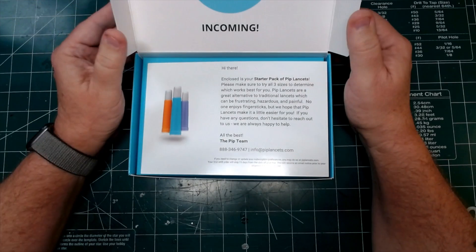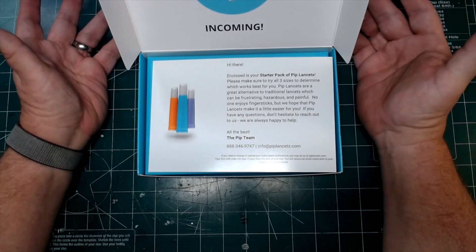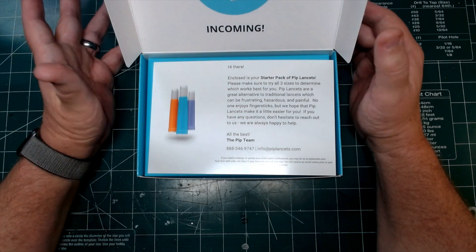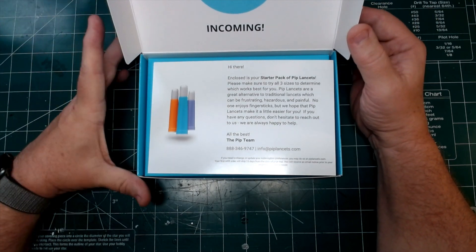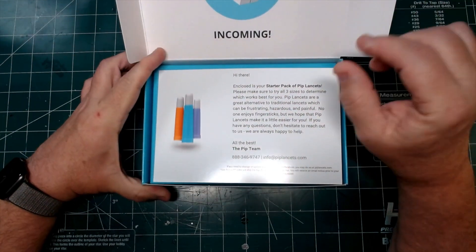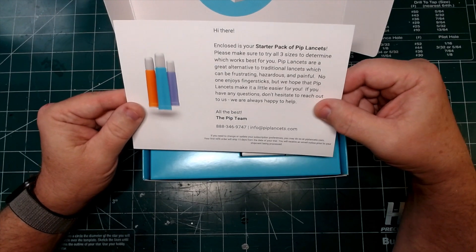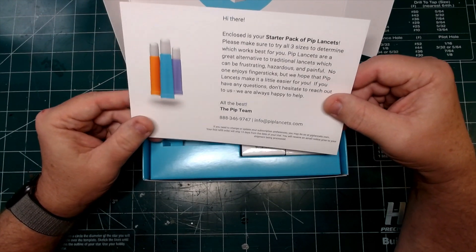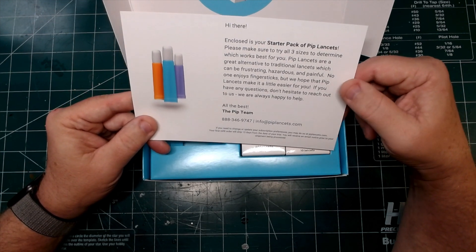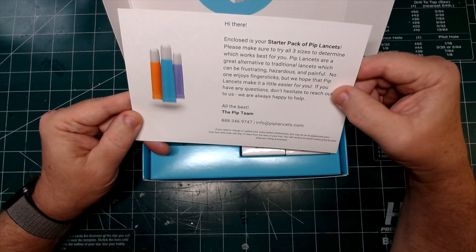I did actually open the box to this level when I first got it, before I realized I need to share this with my diabetic friends. So I stopped right here, closed it back up, and now we'll go the rest of the way together. Inside the box, we have a little card that reads: 'Enclosed is your starter pack of PIP lancets. They're a great alternative to traditional lancets, which can be frustrating, hazardous, and painful.'